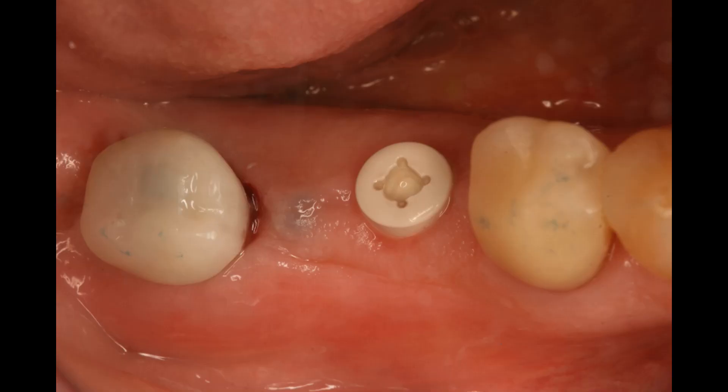If you remember from the x-ray, the two implants are quite far from each other. I decided to place my zirconia implant closer to the natural tooth in the front, which means that in the future I have a choice of restoring that section with a bridge made from the same material — Lava Ultimate — bridged between the two implants. As you know, we can bridge two implants together, but we cannot bridge an implant with a natural tooth.